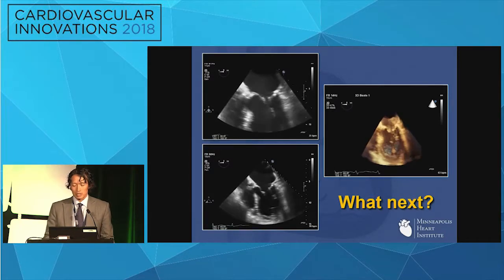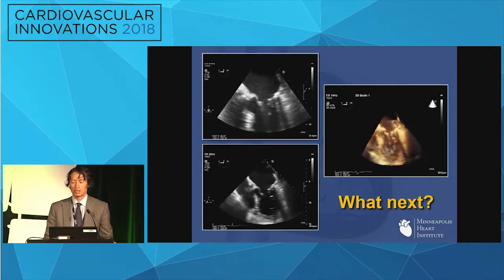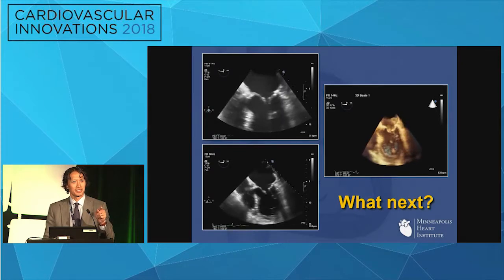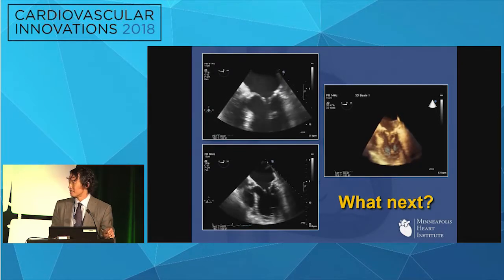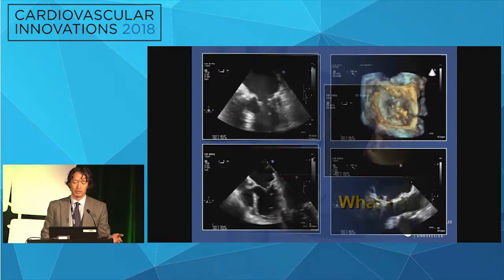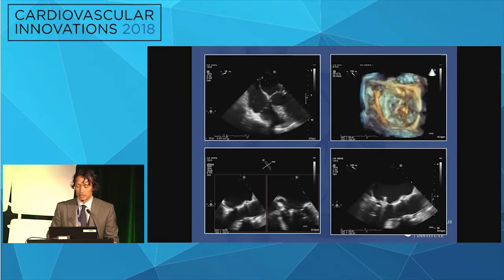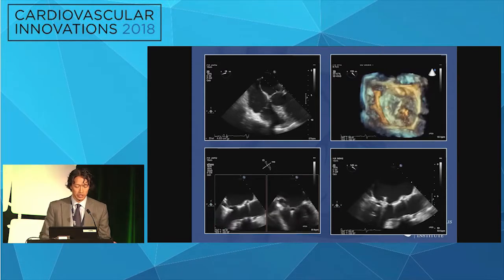So at this point, I was called to give an opinion. Any thoughts on how to fix this? He can't have surgery. He's got a porcelain aorta. He's inoperable. We probably would get sued if he opened his chest. I think, Jonathan, you might have been there, so you can't say anything. Neocord or clip. Yeah, we didn't have neocord, so it was clip. So they asked me, could I clip and take care of this papillary muscle? So I said, well, we'll give it a shot.